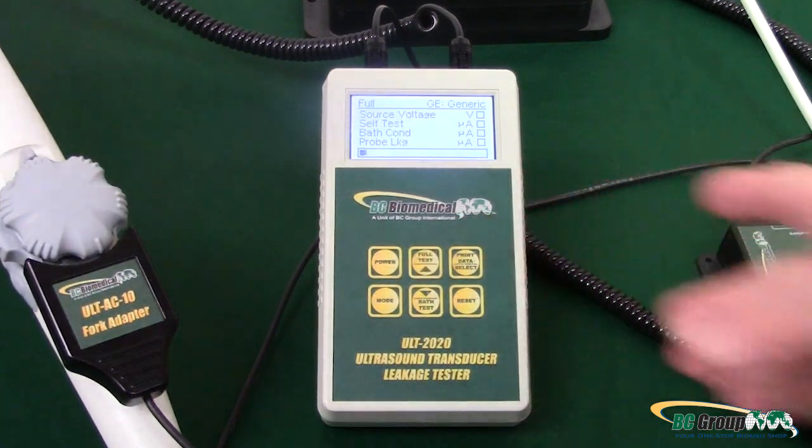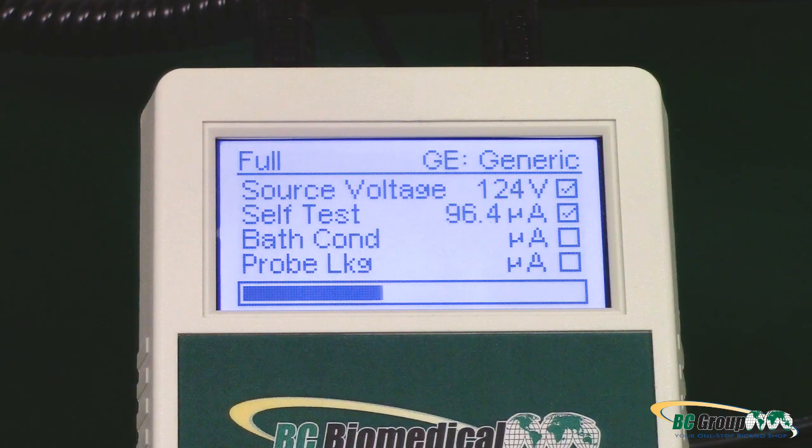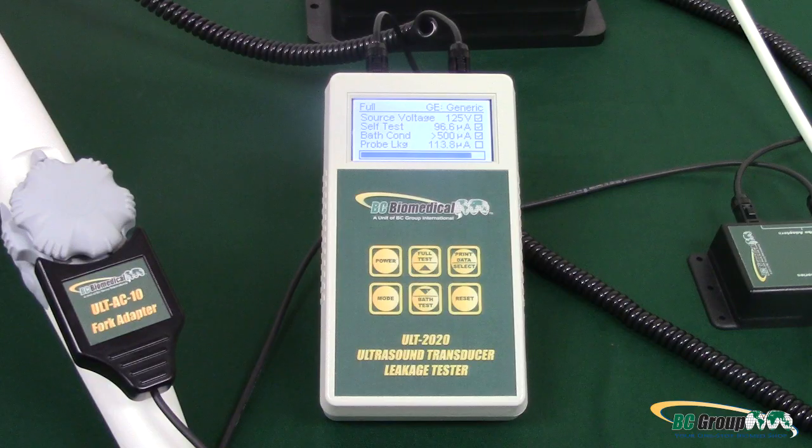Lastly, simply press Full Test to begin the test. The machine will do all the work; you just need to wait for the results. When finished, Pass or Fail will appear on the screen, indicating your results. If a printer is attached, the results will print off in detail along with a Pass or Fail.